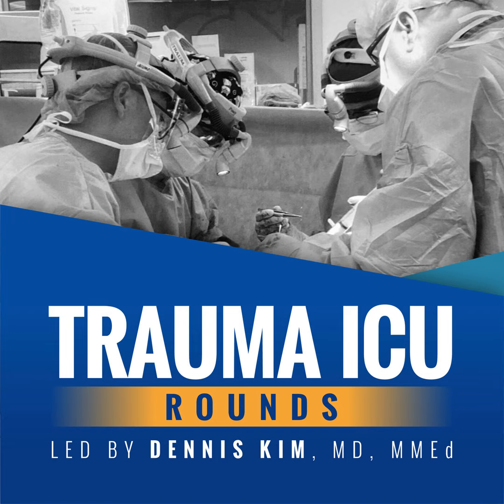Finally, when it comes to that decision to remove the endotracheal tube, be systematic and organized, thinking anatomically. Key things to consider here really are neurologic status, cardiovascular as well as pulmonary status, and concerns with post-extubation stridor or difficulty with potential re-intubation in the case of a failed extubation.